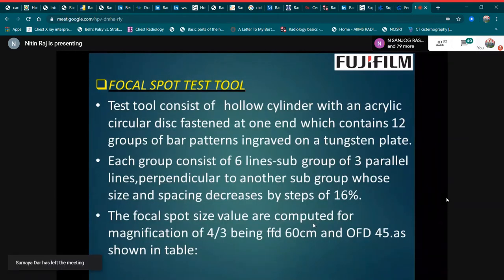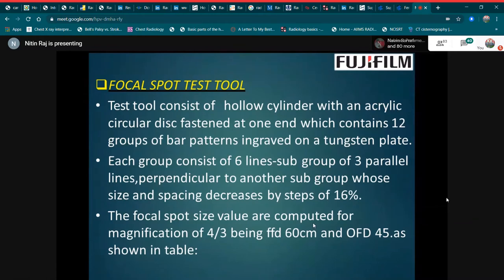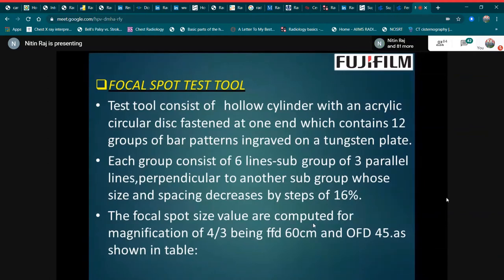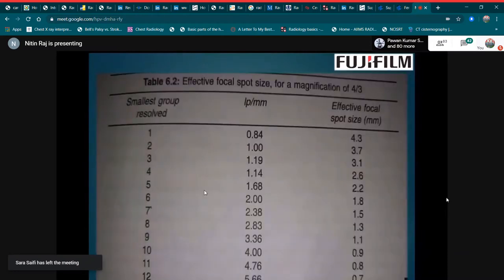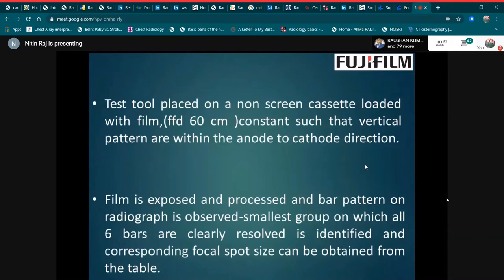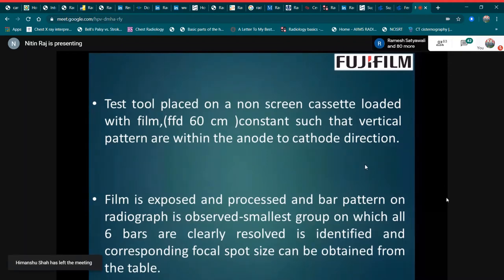Next is the focal spot test tool. This tool consists of a hollow cylinder with an acrylic circular disc at one end, which contains 12 groups of bar patterns engraved on a contrast plate. Each group consists of six lines with subgroups of three parallel lines perpendicular to another subgroup, whose size and spacing decrease in steps of 16%. The focal spot size values are computed for a magnification of four-thirds, with FFD of 60 cm and object-to-focal distance of 45 cm. The test tool is placed on a non-screen cassette loaded with film, with the vertical pattern oriented within the anode-to-cathode direction. The film is exposed and processed, and the bar pattern on the radiograph is observed. The smallest group in which all six bars are clearly resolved is identified, and the corresponding focal spot size is obtained from the table.